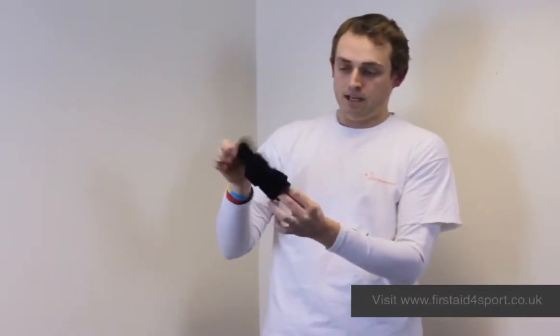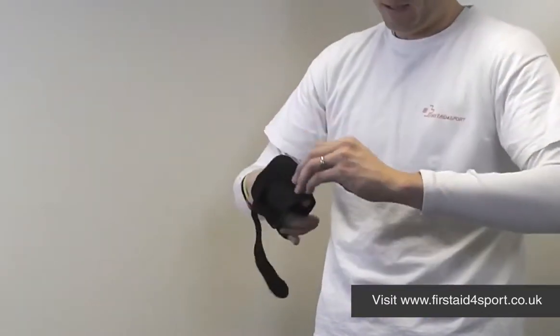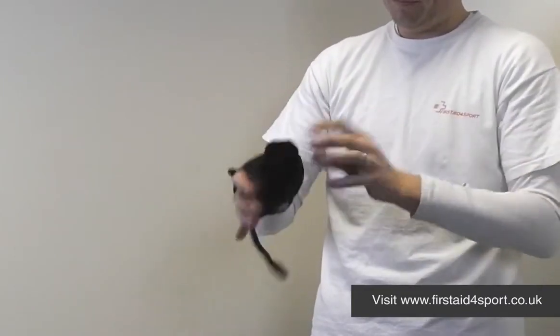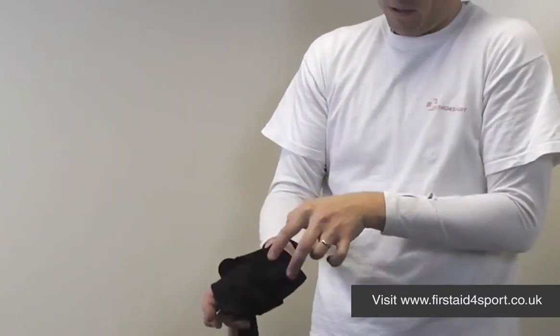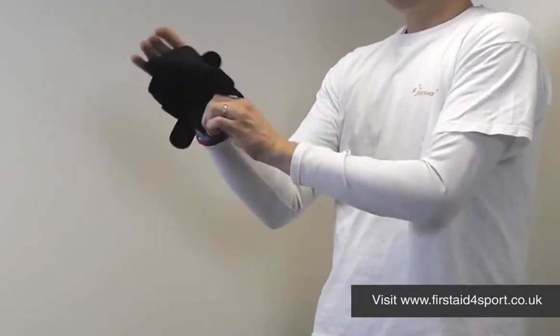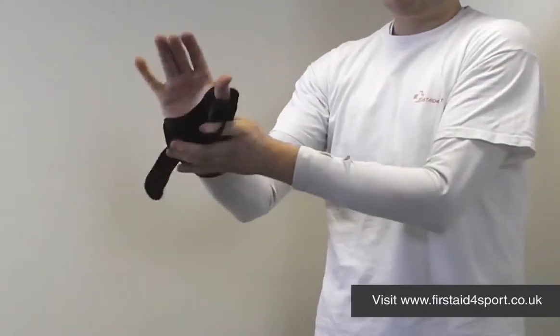Tiny, tiny brace — so simple elastic Velcro around the bottom, elastic Velcro around the top. So you open the thumb brace up. If it's going to go on my right hand, around the top of the thumb, there's down the thumb either side there's a metal stay.